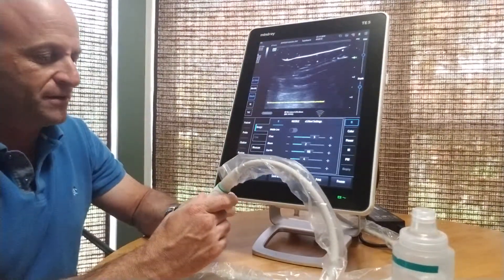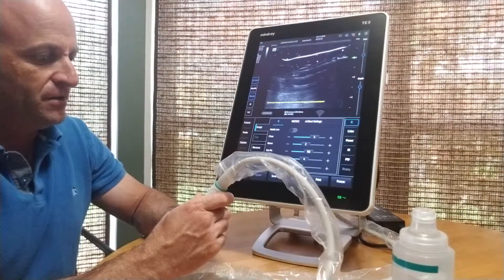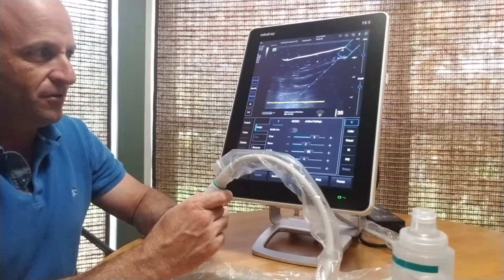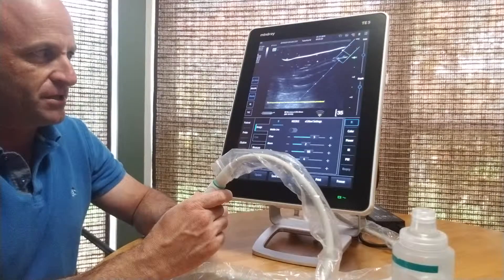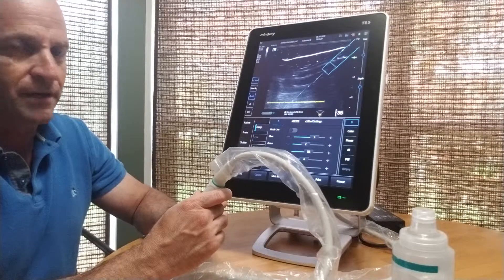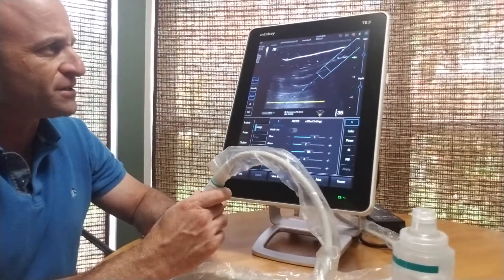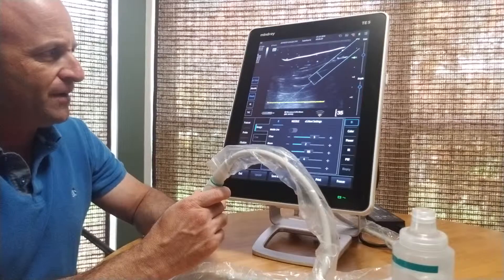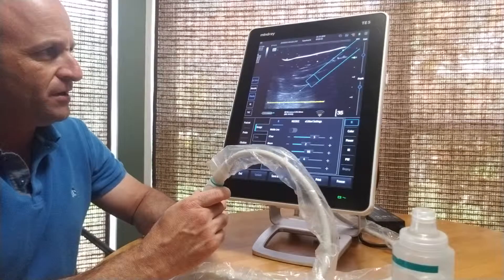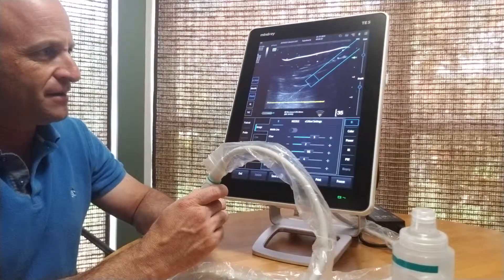So if we're getting ready to scan, we put the needle down — you can already begin to see the marker of the needle as it approaches. We're able to direct the needle accordingly as we're coming in, and you can see the full representation on the screen as the needle is going. We have the different angle that we're presenting at, and then we also have the guide.